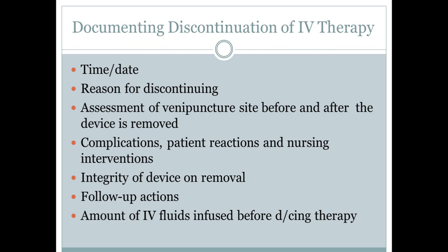When I remove the catheter, it's very important that I inspect the catheter as well as the catheter tip to see if the tip might have broken off, or if there was anything wrong with the tip. Very, very important that I document that, as well as let the doctor know, because if something did happen where there is a piece of the tip still lodged in that patient, we might need to do something further, because that just puts them, again, at a high risk for infection and complications.